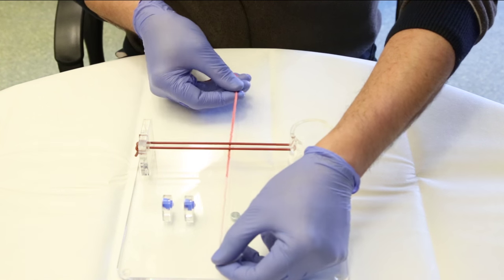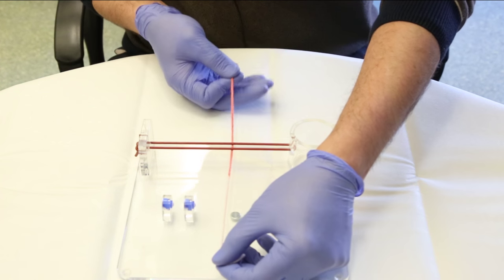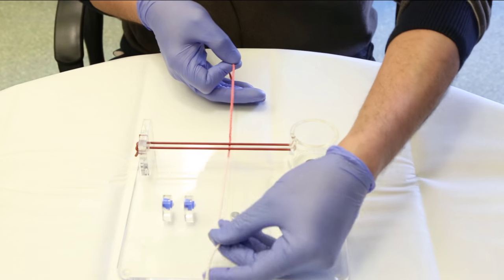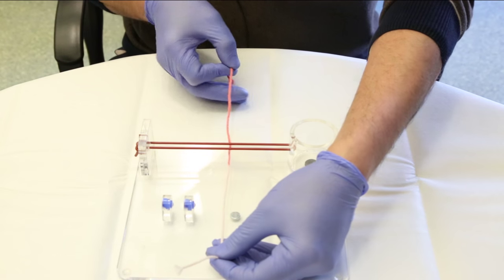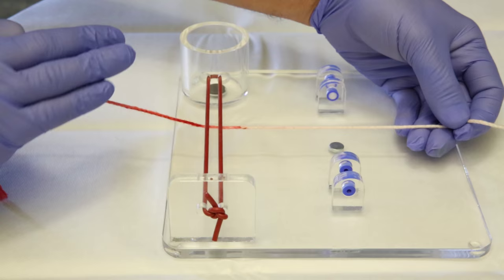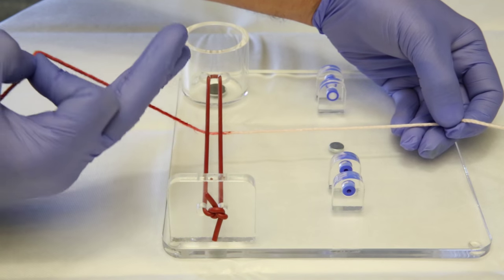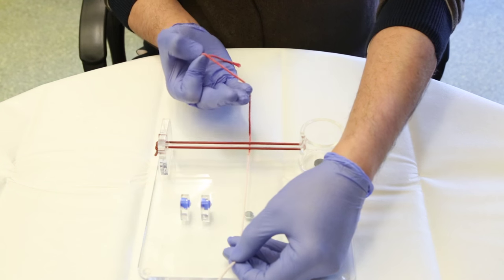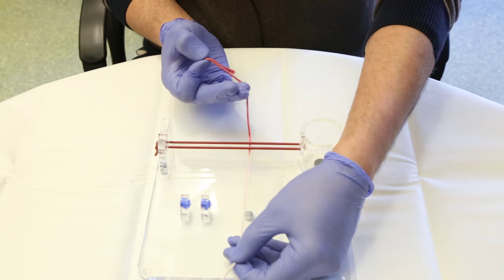One of my hands is close to my body, which is my right hand, and the other hand is away from my body, which is my left hand. The hand I'm going to use to make the knot is my right hand because I'm right-handed, but if you're left-handed I advise that you do it on your left hand.